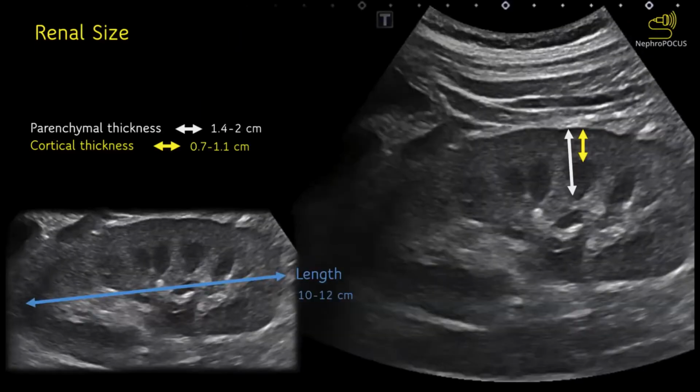That's the deal with obstructive. So I did not really go into depth. Obviously, you know more than me in terms of various scenarios, obstructing stones, those twinkle artifacts and stuff. But I hope those cases were helpful.